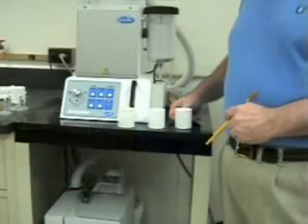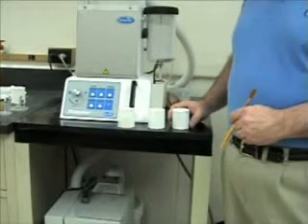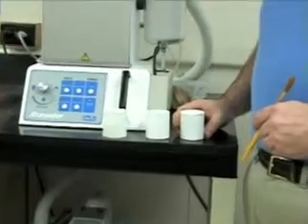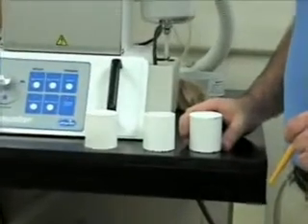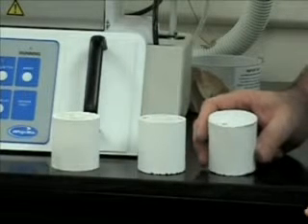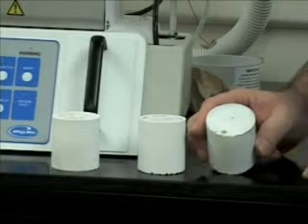Okay, the next thing we're going to discuss is some troubleshooting of typical cutting issues, and we'll show you some examples. Now we're going to talk about what might happen if you put your mold into the unit, pushed a button, left the unit on its own for a time and came back, and upon removing the mold, you discovered some typical artifacts.